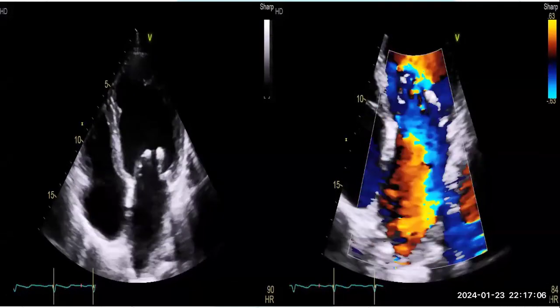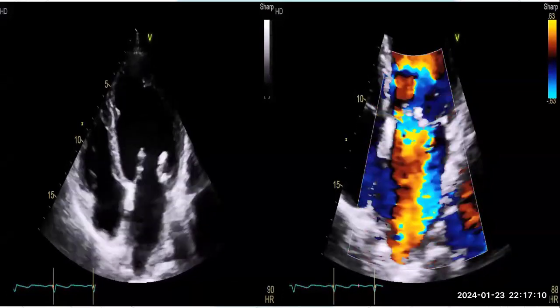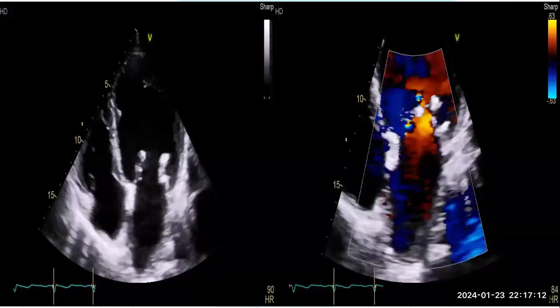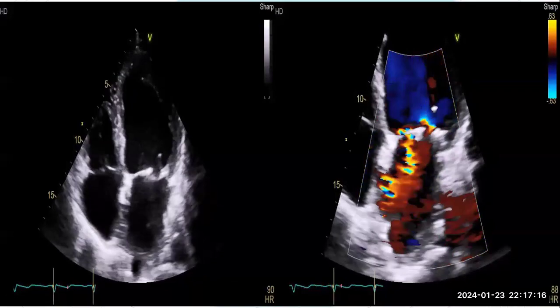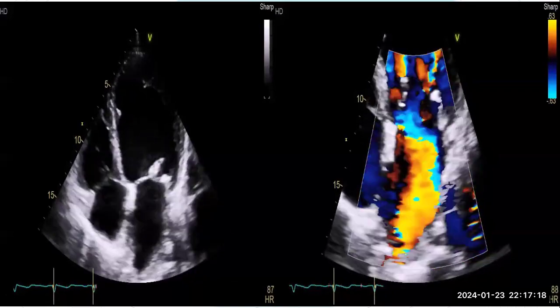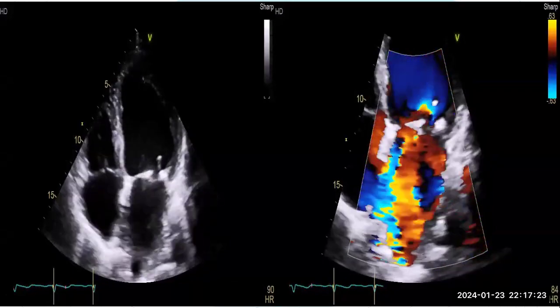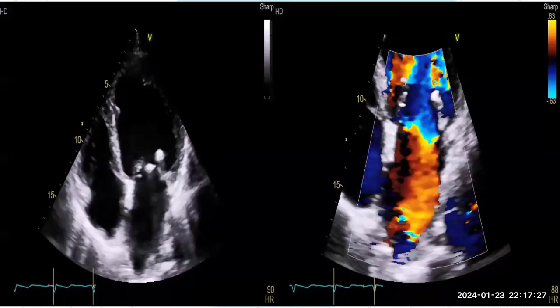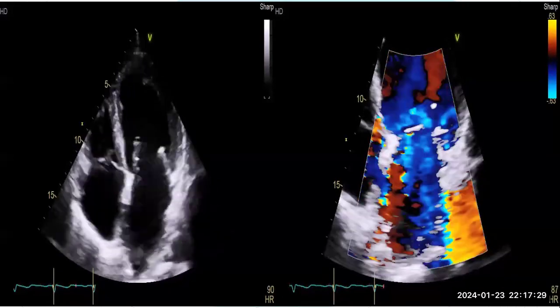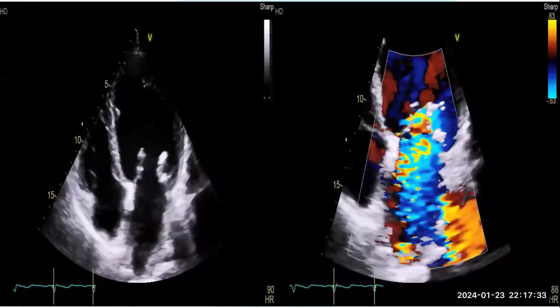This case came as an OSCE station in the exam. I need a description. If you want, I can give you history, then we can give history as well. What do you see, Ashraf? Can I attempt this as well? Okay.